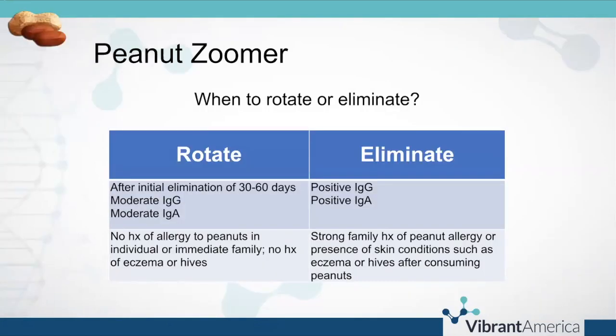Now, as far as results, there are some things to consider here: when to rotate, when to eliminate.